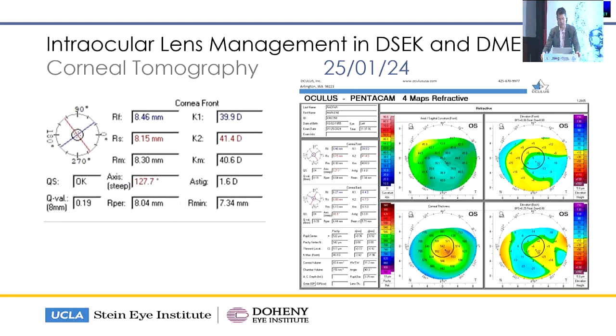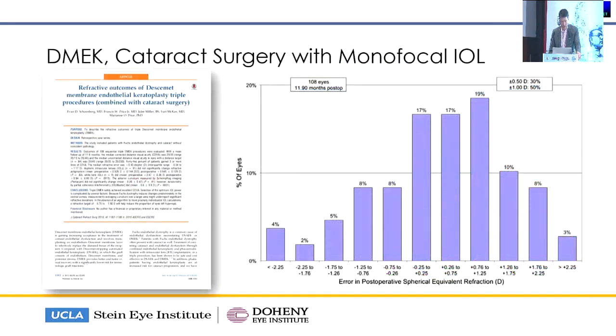So here the problem is, and you can see on the axial map, we have a much flatter cornea, due probably to the subtle subepithelial scarring that she has that was a result of the epithelial edema. I looked very carefully pre-op, I always do for subepithelial scarring, but you guys know if the pachymetry is 800 and something and you have epithelial edema, it's very hard to determine if there's any subepithelial scarring there, and if so, how much. So how common is this?